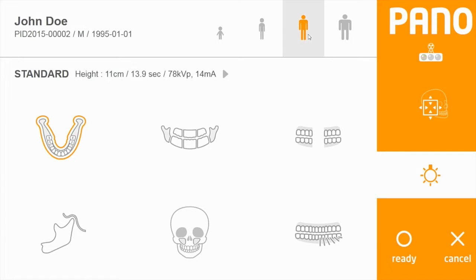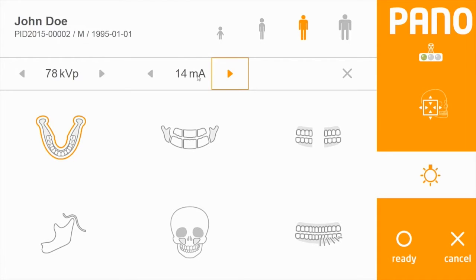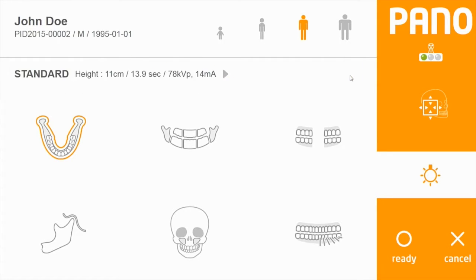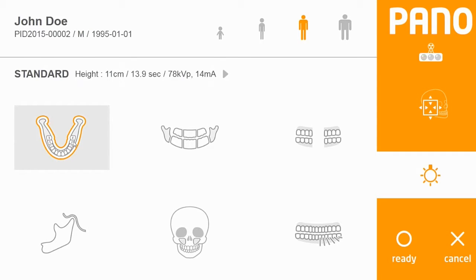If these preset sizes are not adequate, you can use manual adjustments with kV and mA settings. The middle section of the window shows protocol options. The default is the standard panoramic option.